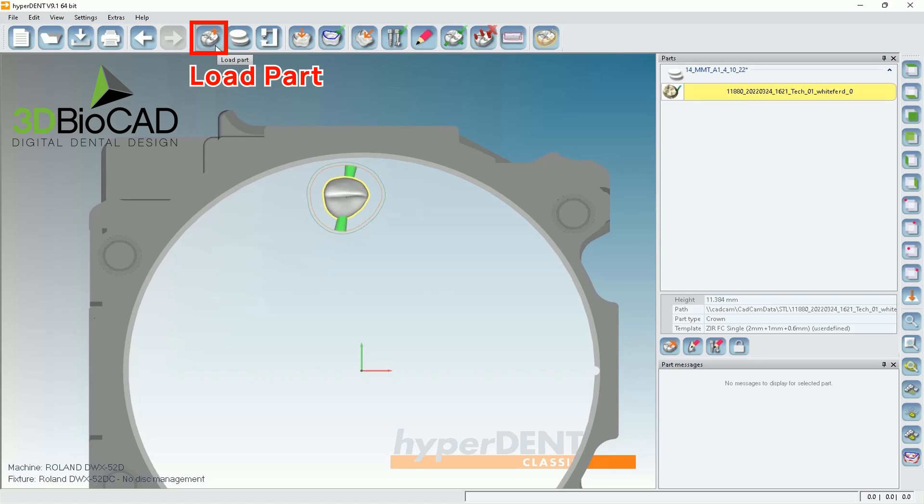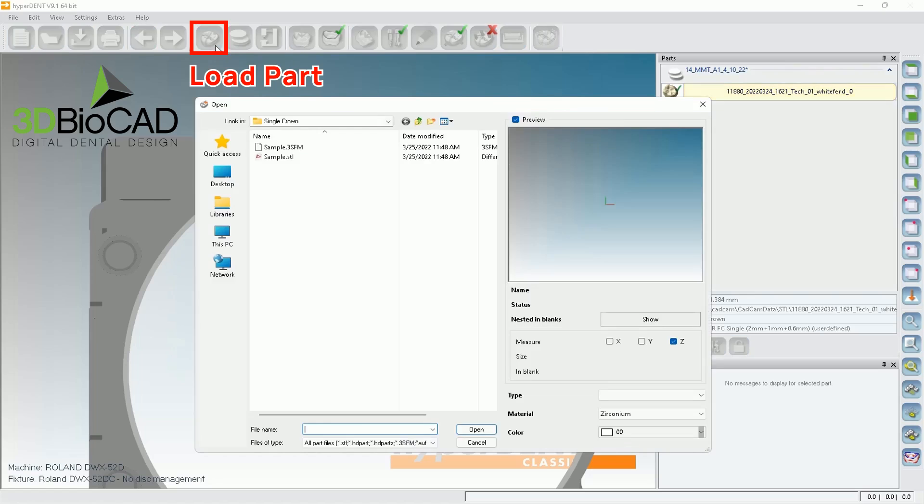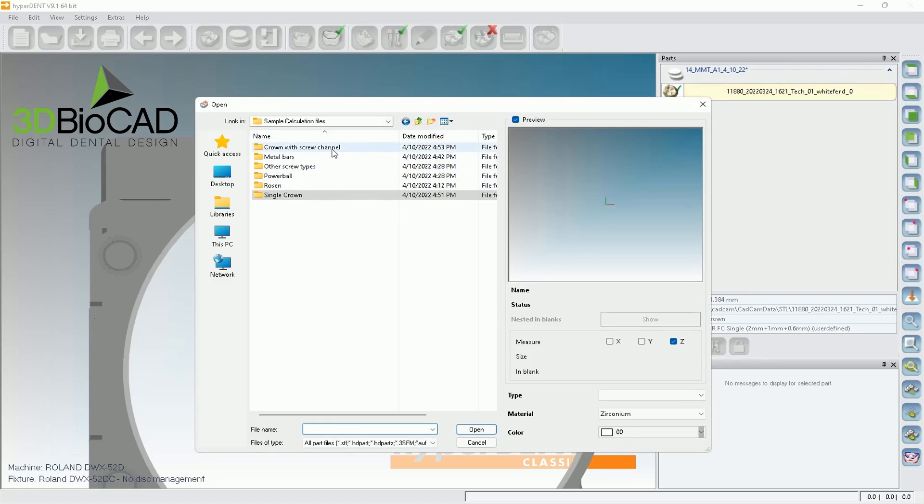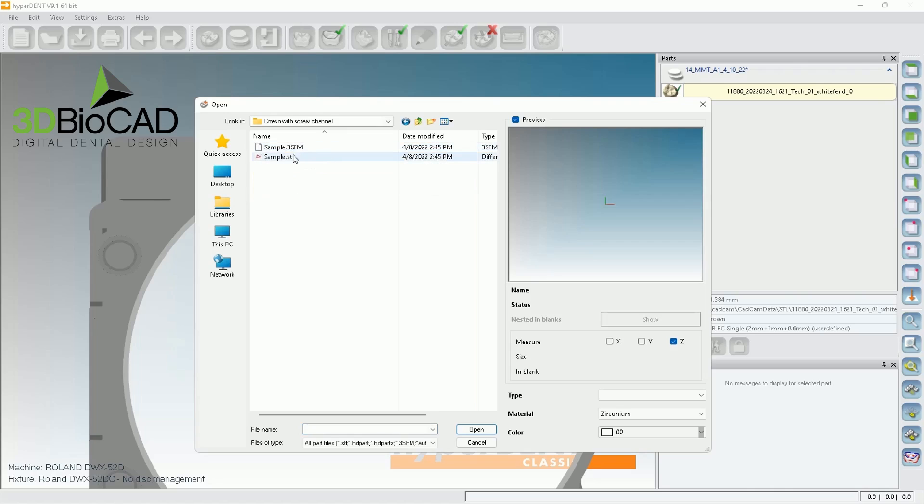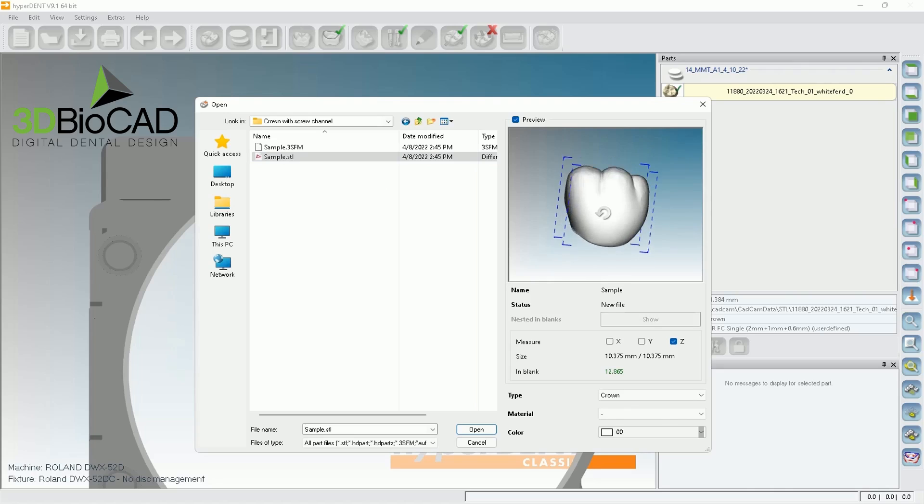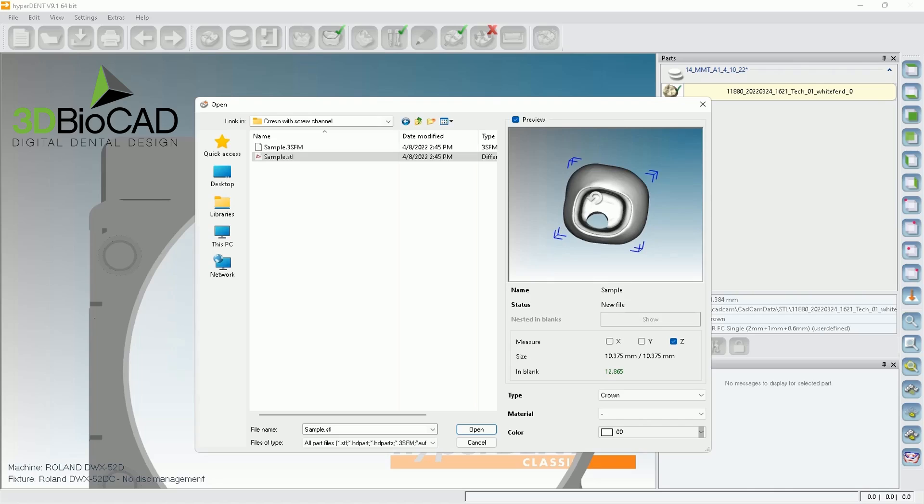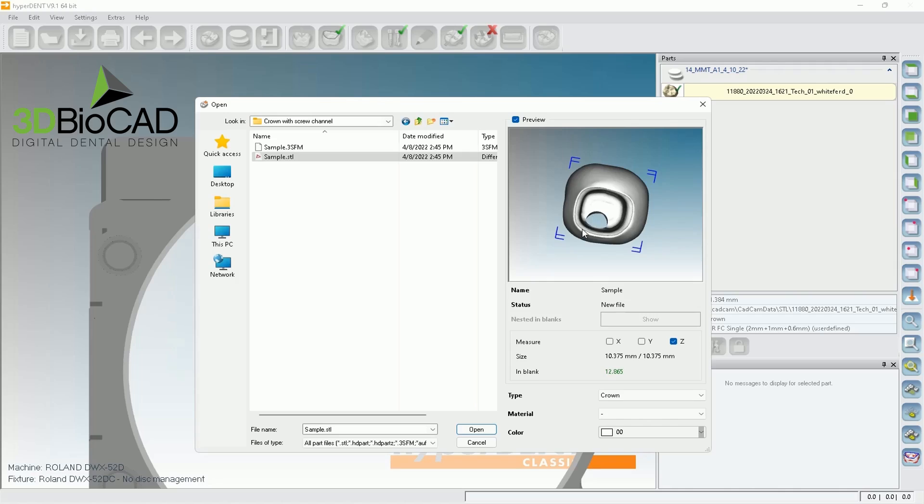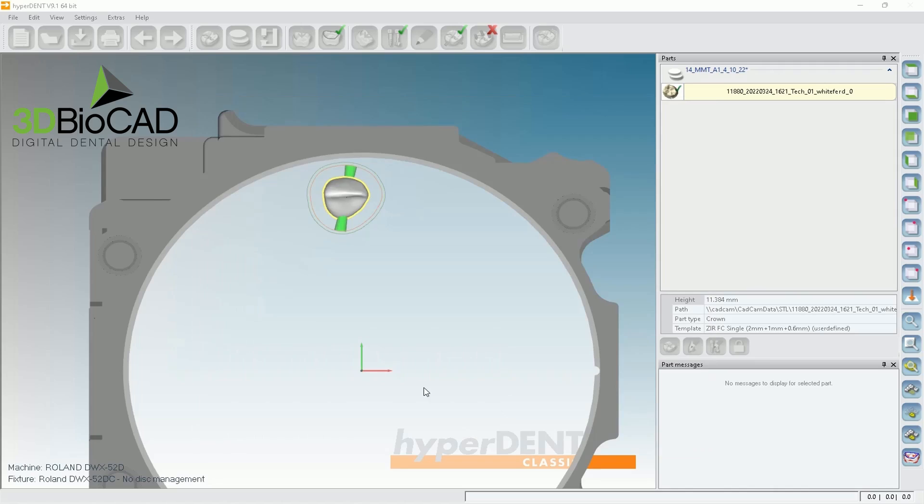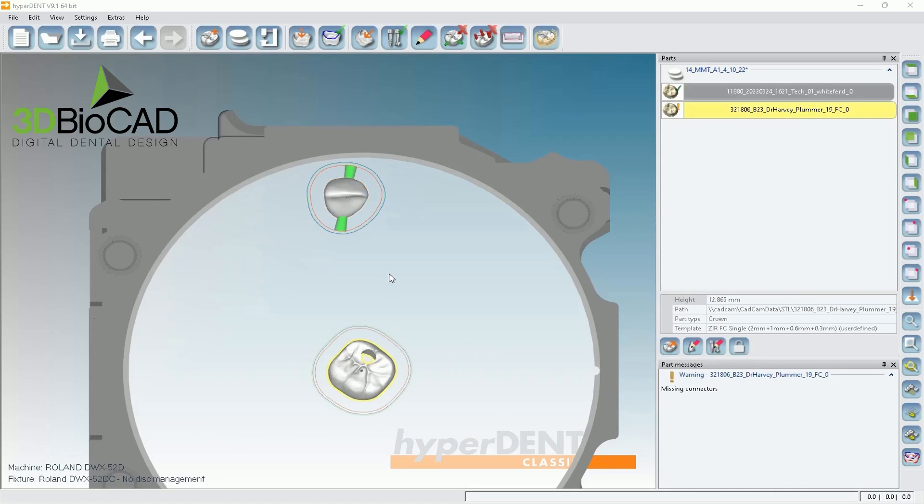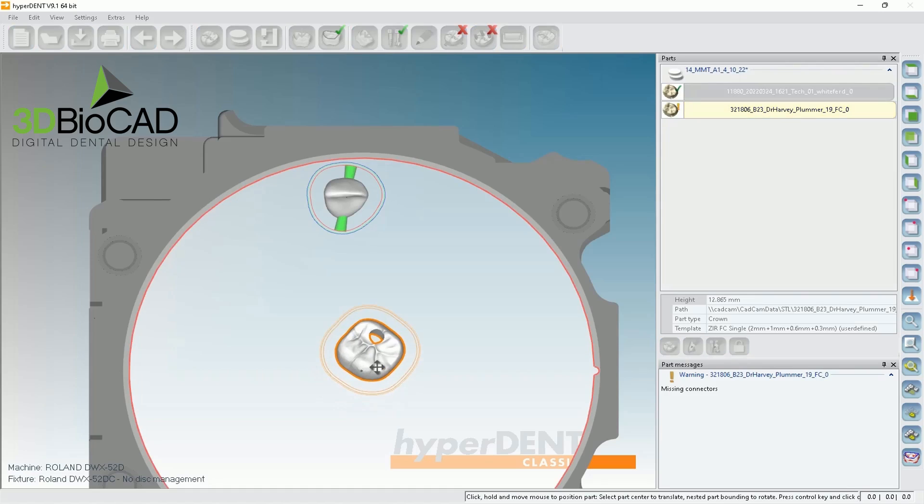So let's go to load part again. Go to crowns and another sample. If you look at this case, it's actually a crown going on top of custom abutments. So basically, this is a crown, but with the hole. So in this case, let me show you how you can select. So open and you can double click and move.